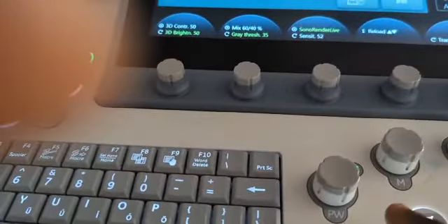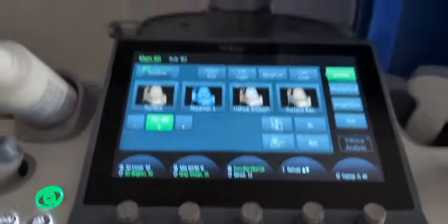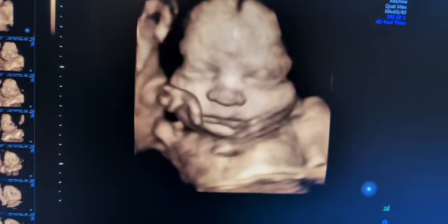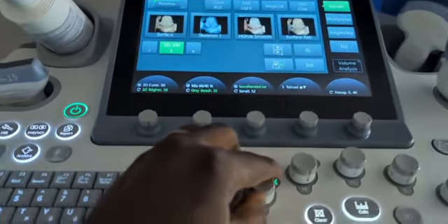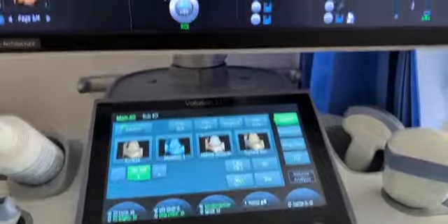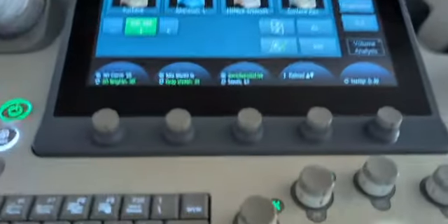So let's start from the X coordinate. When you turn your key, what happens to the baby? I turn this key, so I'm going to show you what's going on. It changes the orientation of the baby in the X direction. You see that I'm turning it, and see what's going on with the baby. So that's what happens with the X coordinate.